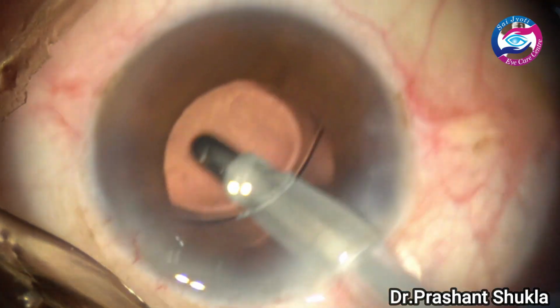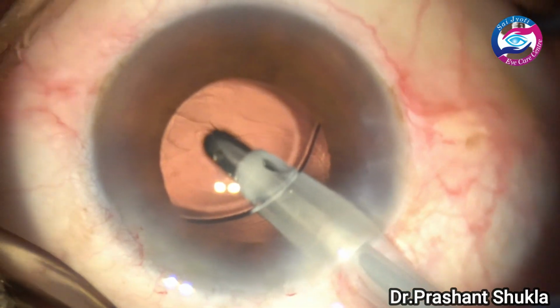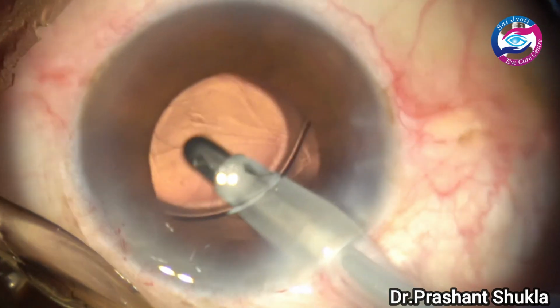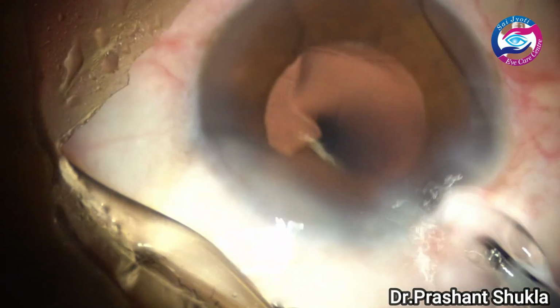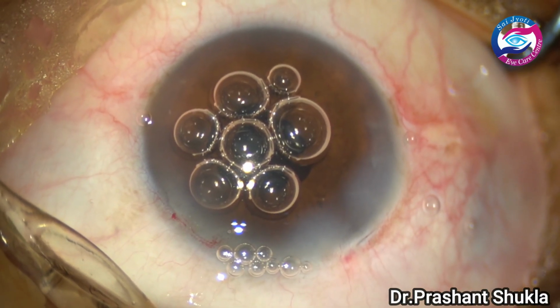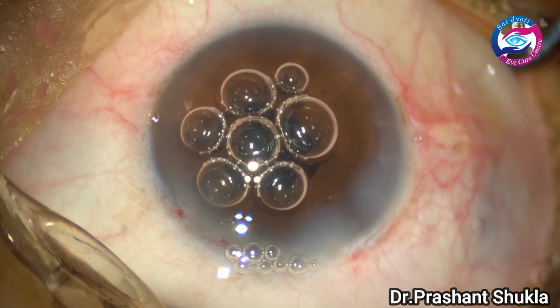So one can always have an idea if the lens is slightly decentered. It might be because one haptic is in the sulcus and the other is in the bag, and many a times when we have not so good pupillary dilatation, as in this case, which is about 3.5 to 4 millimeters. So we should always check whether the haptics are in the capsular bag or not. So that's the case done, and the wounds are hydrated.